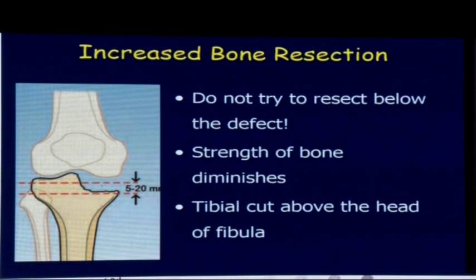And almost certainly, you should never cut below the head of the fibula. The caveat there is, there are some patients in whom the fibula head is quite high preoperatively, and if that is the situation, then it is imperative that you will do that. But you need to be very careful that you don't actually land up way beyond the fibula head.